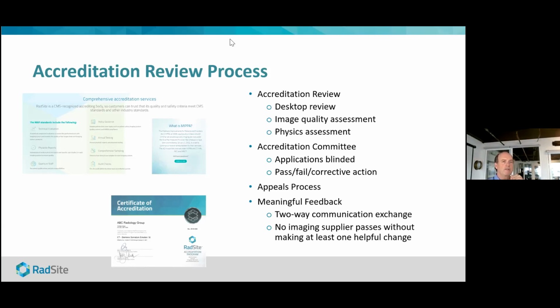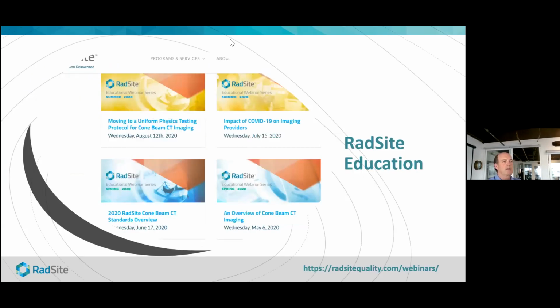And for the dental office, as Dr. Siegel described, it's going to be cone beam CT more often than not, and then these other areas too. If I'm seeing an ENT, why do I get referred out at a later date to get a CT with more ionizing radiation when a cone beam CT at the office while I'm there can make a difference? If I'm getting knee replacement surgery, why don't I get the image from a cone beam CT unit where I can put weight on that knee in the office versus being referred out later? It's just such a time saver.